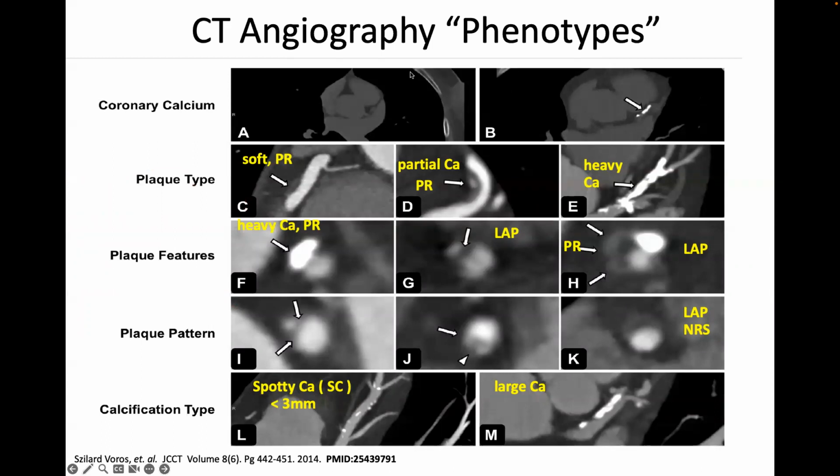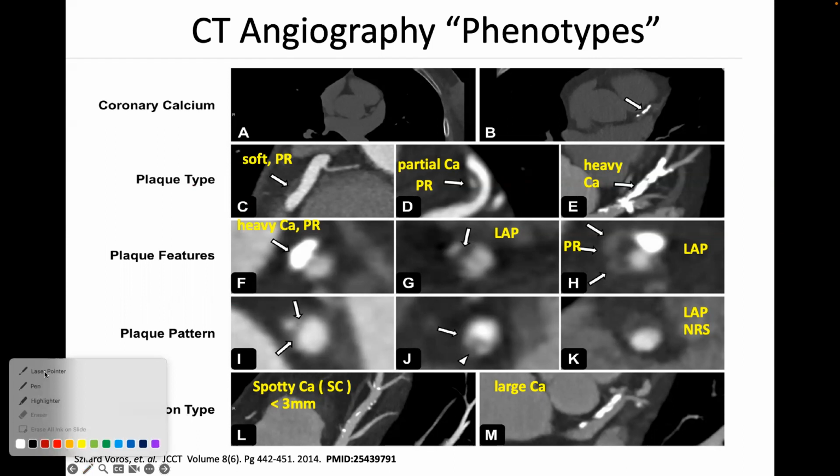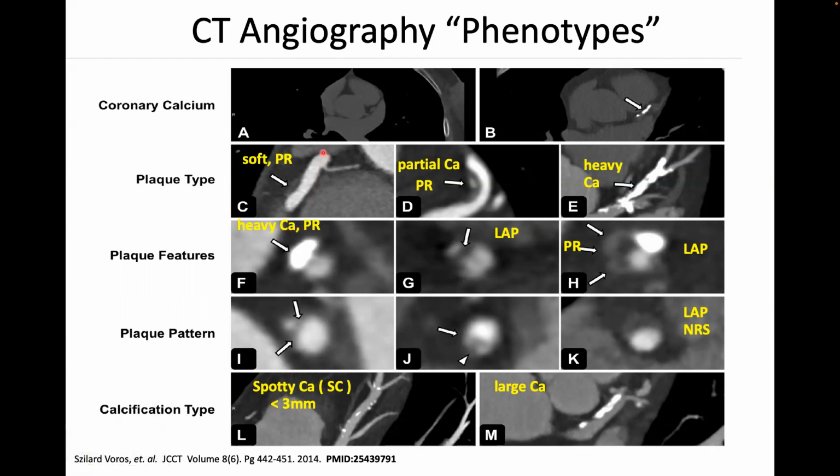The other interesting thing about CT is that unlike X-ray angiography, in CT you can exactly see the components of the lesion, right? If the image quality is high enough, you will be able to look at different components of these lesions. They're not all built the same, right? So let's look at this. So here, this is plaque type across here. And this is called soft plaque.